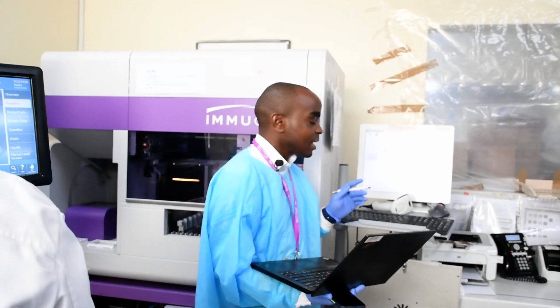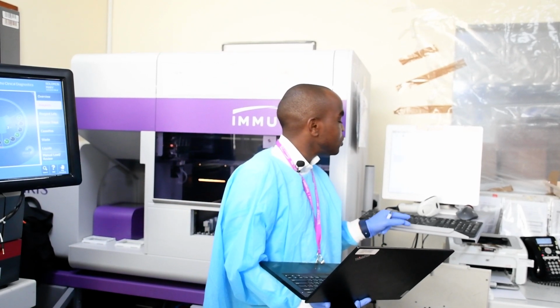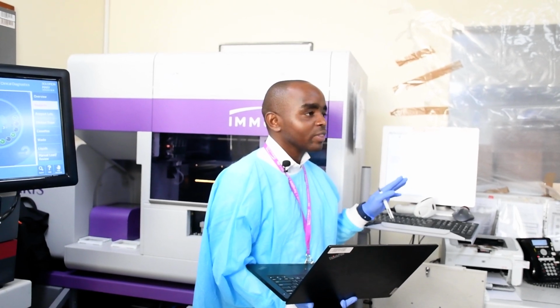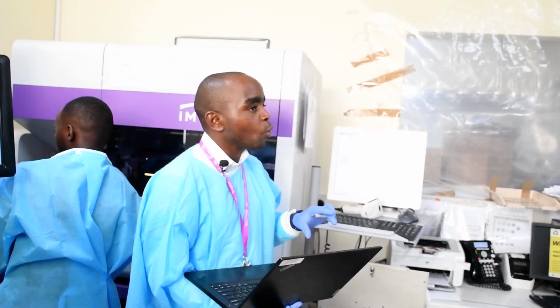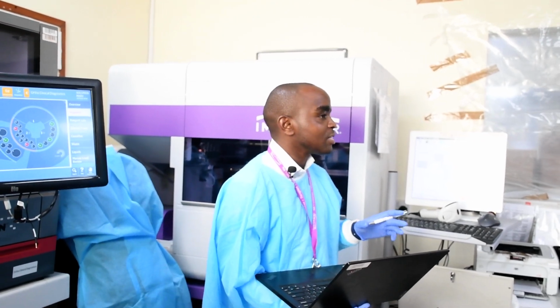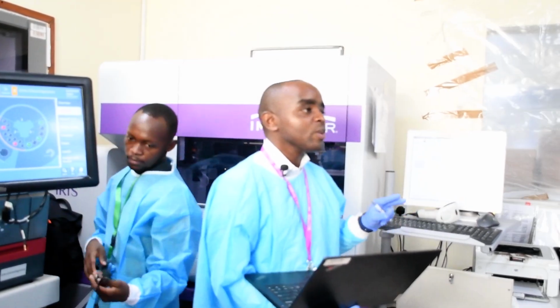Naturally occurring, the IgM type, but these ones also are capable of causing hemolysis. So now, we have different applications, but for your case, it is probably when you are doing platelets. Also, when you are doing blood group O, the latest suggestion or direction is that you have to do AB titers, the antibody A and antibody B titers for all blood group O donors.